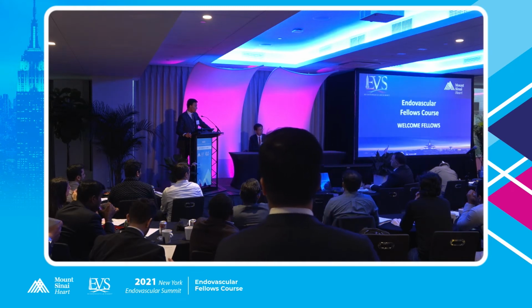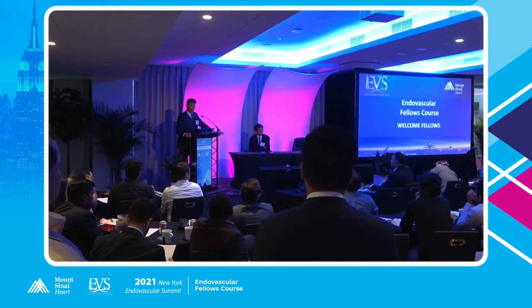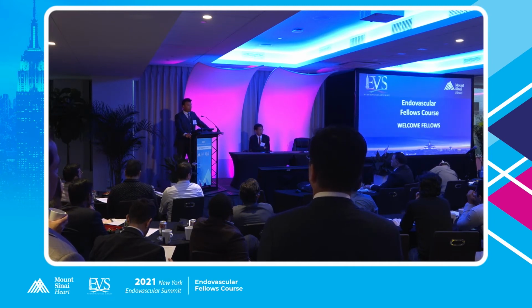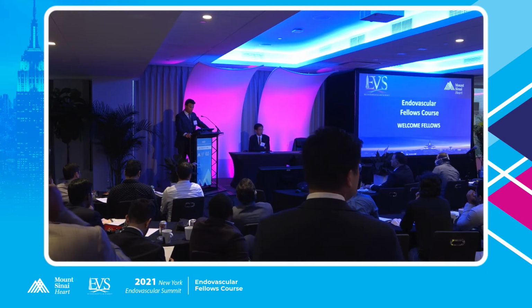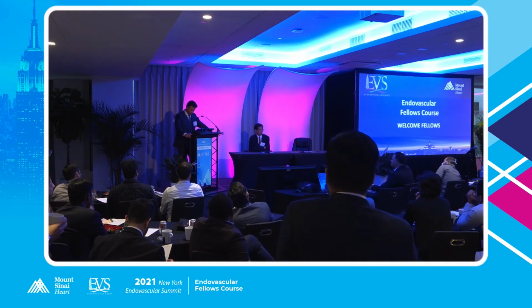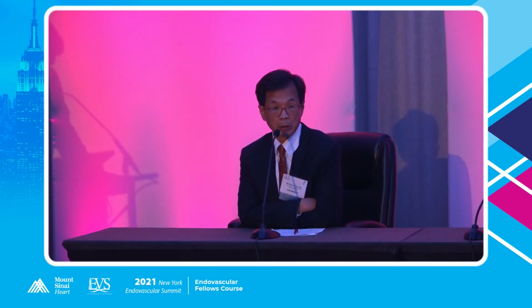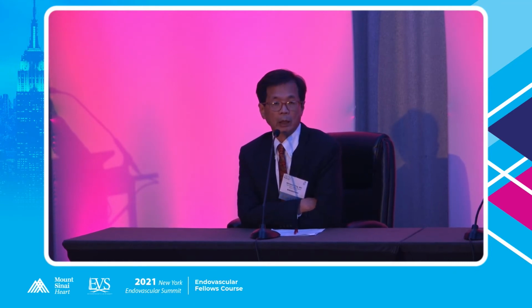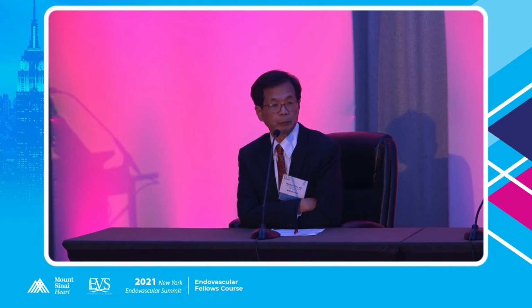I usually approach it from an ipsilateral side, from below the blood clot. In that one case, I went up and over from the other side. In that particular case, the stenosis in the common femoral vein was pretty low. I felt I would place the stent better by going up and over, so I can put a stent pretty distally, and that's what I did. So usually ipsilateral, occasionally from the contralateral side.